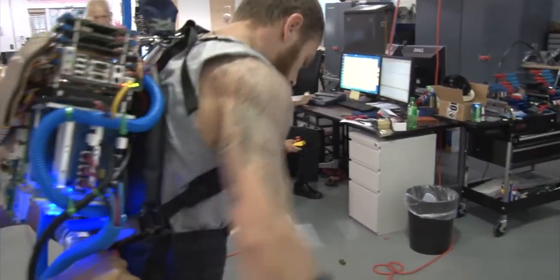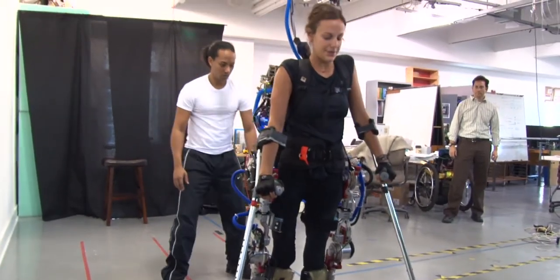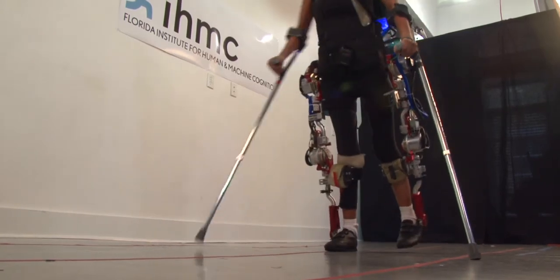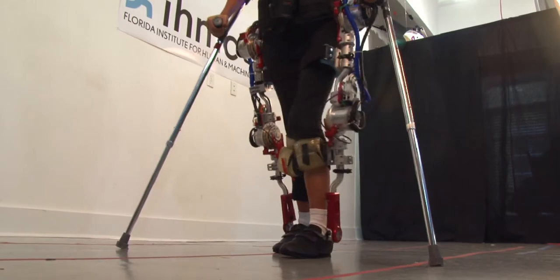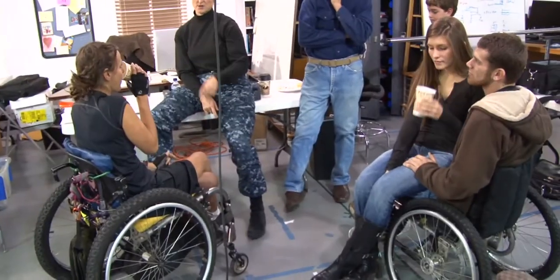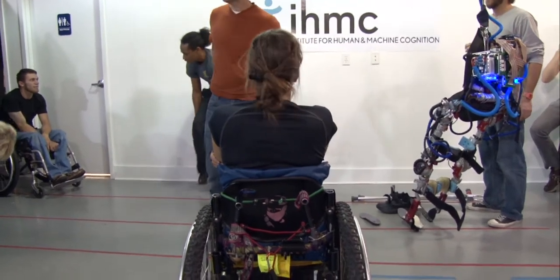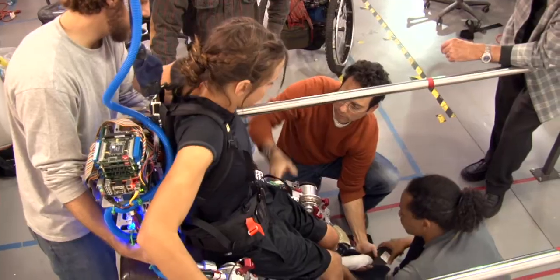Our research started with a mobility assistance exoskeleton with motors at the hips and the knees for sagittal plane motion. We were able to provide mobility assistance for two persons with SCI complete injuries — they had lower extremity paralysis and were not able to walk on their own.